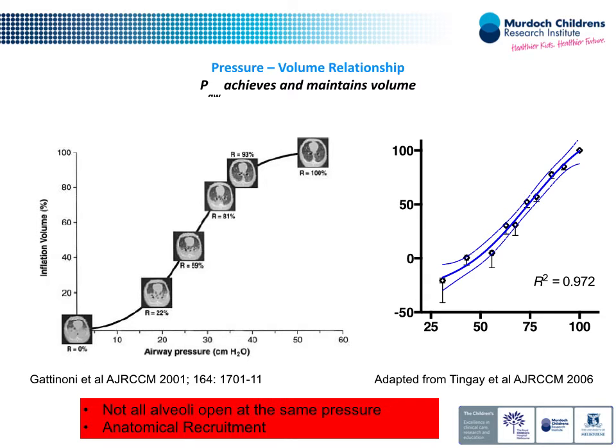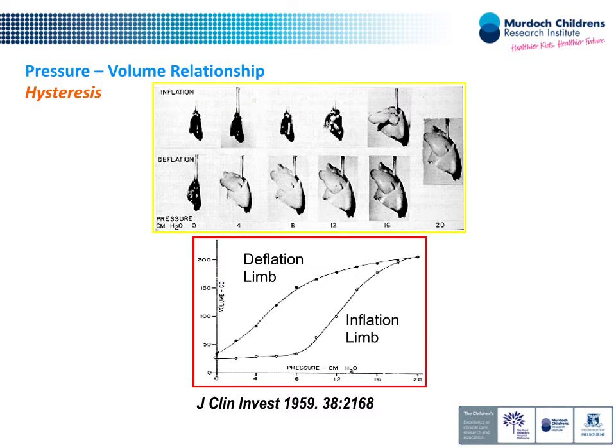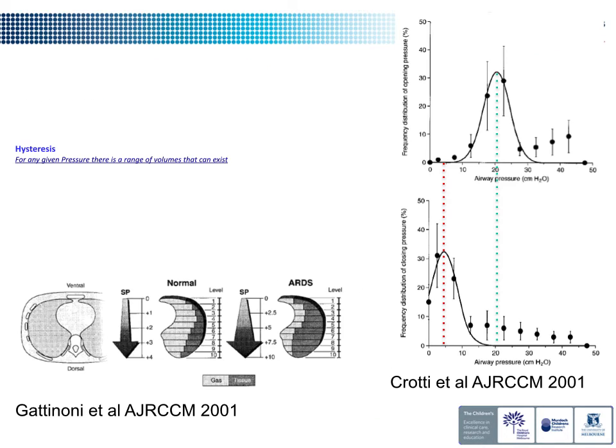What we want to do is recruit the lung. So we want to try to get it to behave like this. But you're exactly right. As we walk up and start the recruitment, we will be causing overdistension in the bits of the lung that recruited earlier because every alveolar has its own lung mechanics. And all we know at the bedside is what the whole lung's doing, which is the sum of the parts.